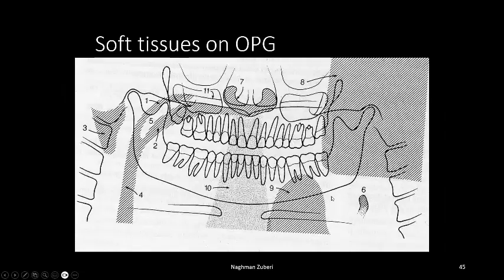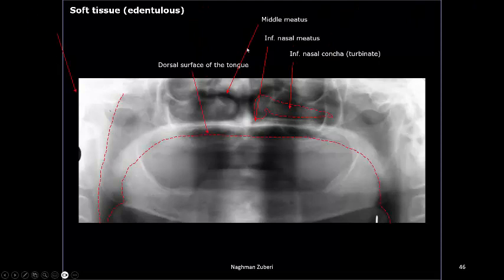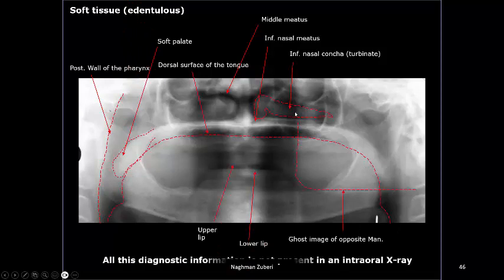Soft tissues are also visible on an OPG. Using an edentulous arch as reference, one can identify the inferior nasal concha, inferior nasal meatus, middle meatus, and the dorsum of the tongue. The soft palate and the posterior wall of the pharynx are also visible, as are the upper lip and lower lip.